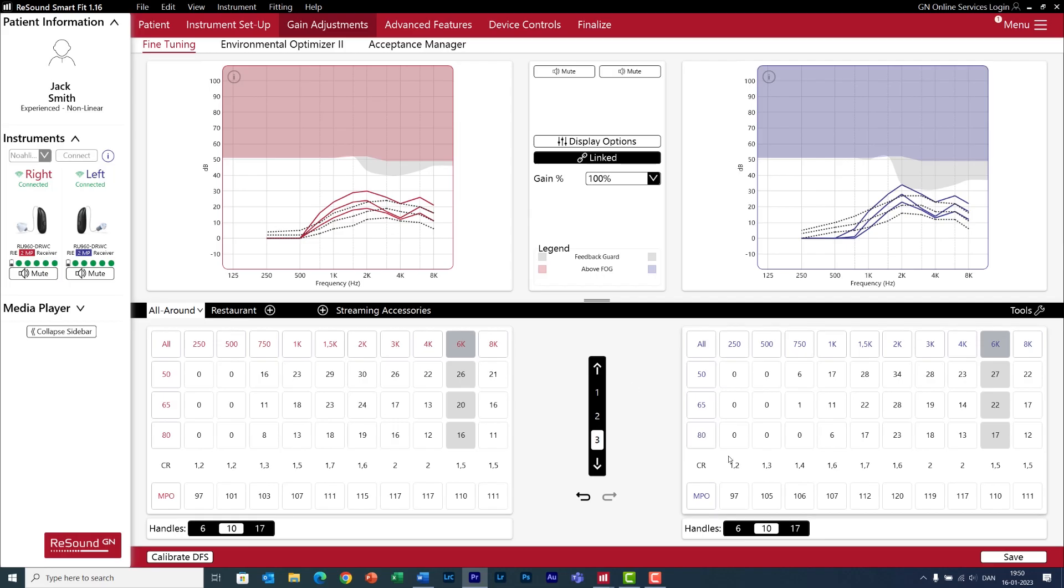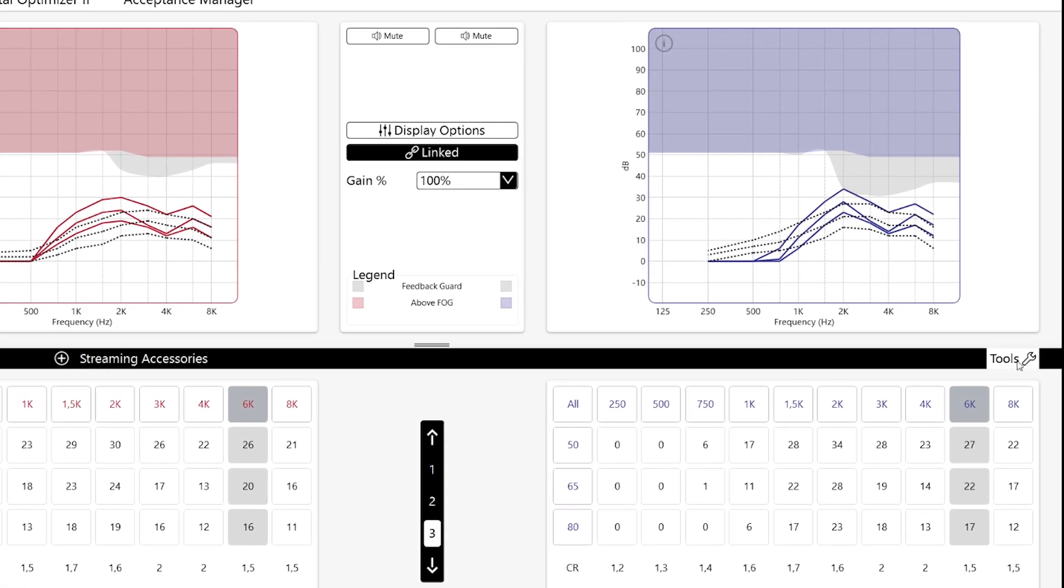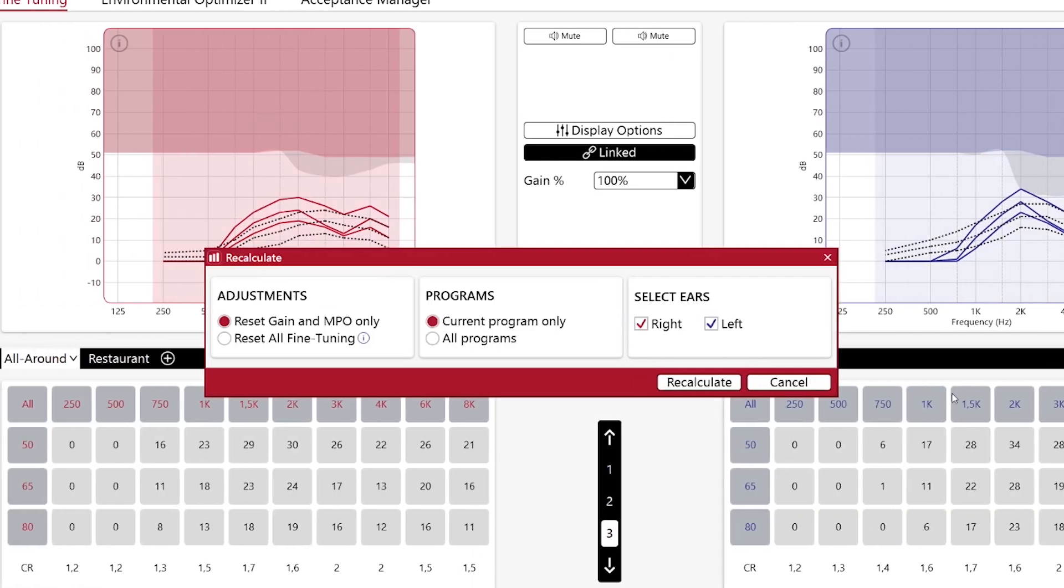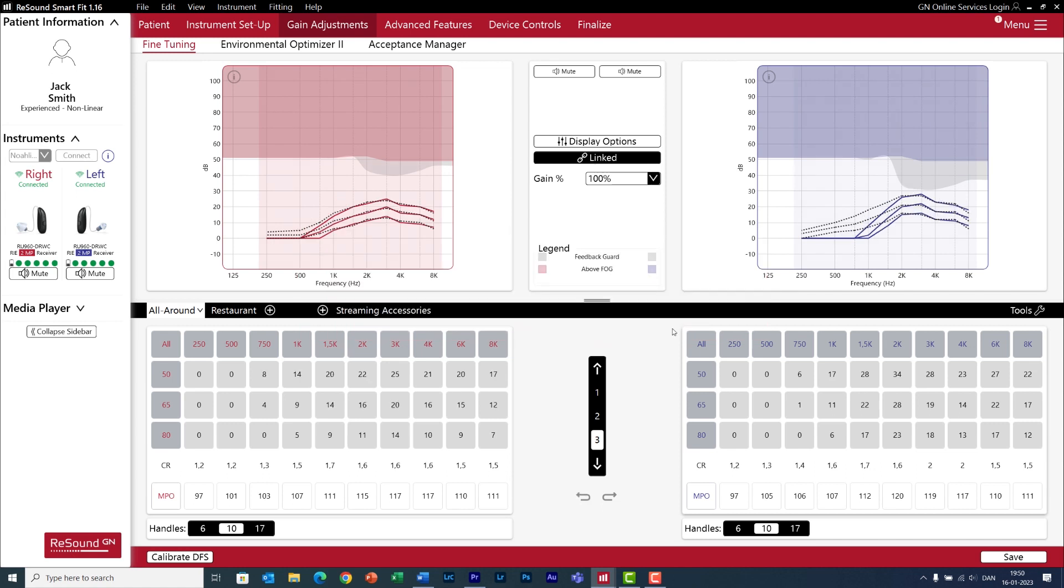Sometimes you may want to go back to the default settings recommended by the fitting software. The easiest way to do this is with Recalculate. Click on Tools, Recalculate, and now you can decide whether you want to reset just the gain levels, or perhaps also the fine-tuning. Click on Recalculate, and voila!